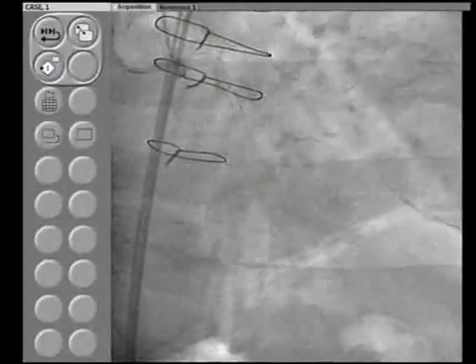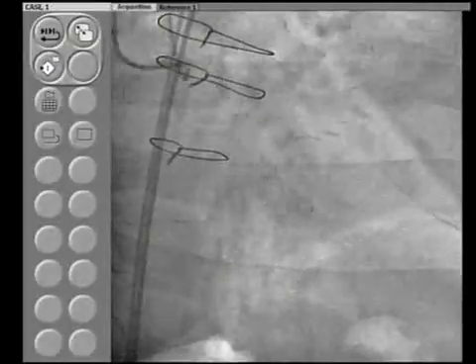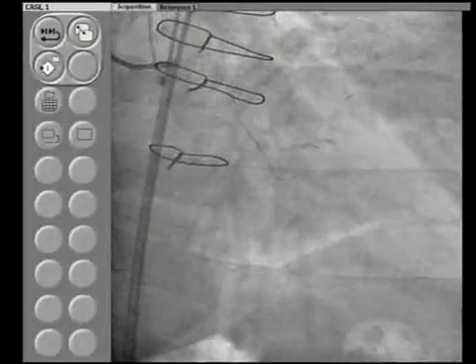You look to have created a subintimal channel right in the mid portion there. Okay, come out. Just 1 second. Okay. Little dive with the side. Retrograde. This one.